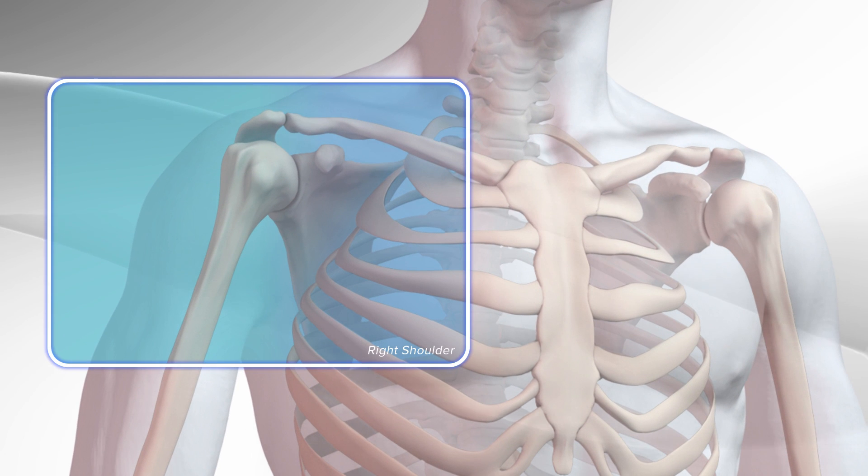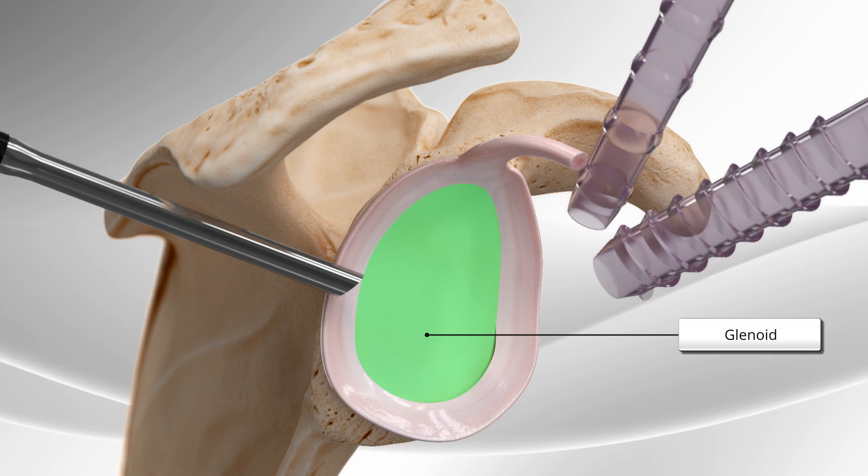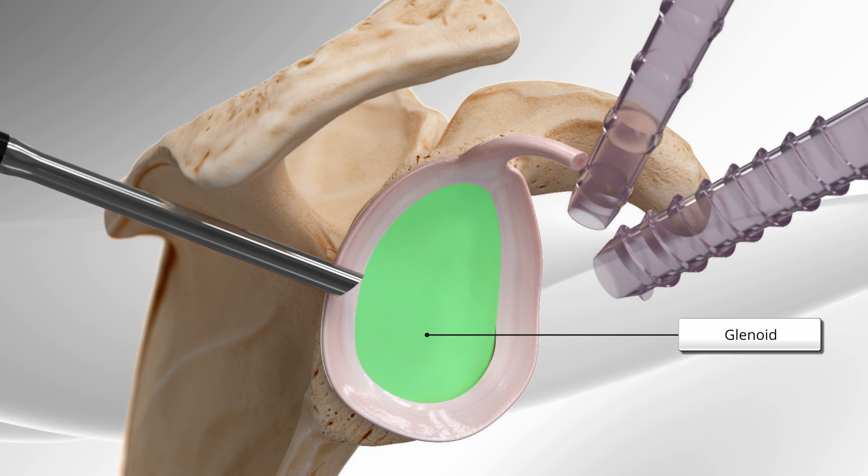Demonstrating a shoulder instability repair located in the glenohumeral joint using suture anchors. The glenohumeral joint, or ball and socket joint, is responsible for the majority of movement in the shoulder.